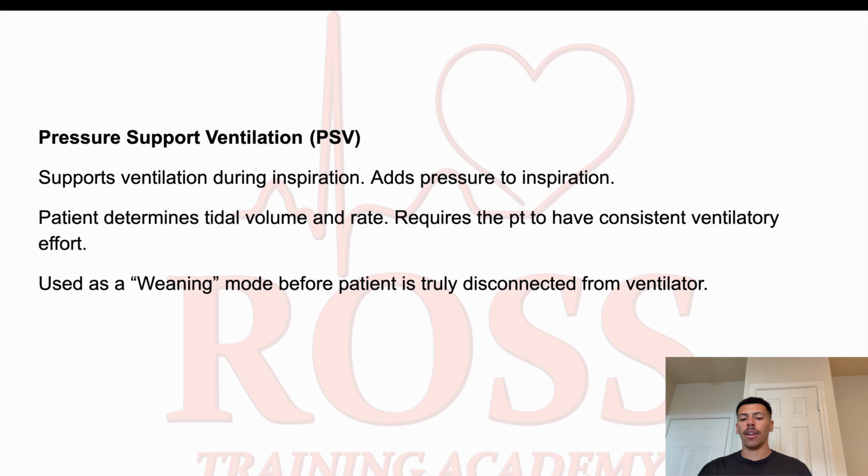And then our last ventilator mode is going to be PSV. And this is going to support the patient's ventilation during inspiration, and it's going to add just a little bit of back pressure to the patient as they're breathing in. The patient's going to be able to determine their tidal volume and their rate, so they're going to have an intact and consistent ventilatory effort, respiratory drive. This is typically going to be used to wean the patient off of the ventilator and strengthen up their lungs before we completely disconnect the ventilator and monitor them.